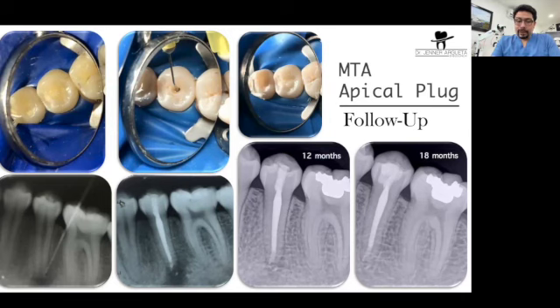And the clinical practitioners can do a lot of treatments without the help of magnification, but forcing the eyes, generating stress, not being so precise. And definitely there are some treatments that cannot be performed without the help of magnification, or they can do it, but the success rate will be lower.